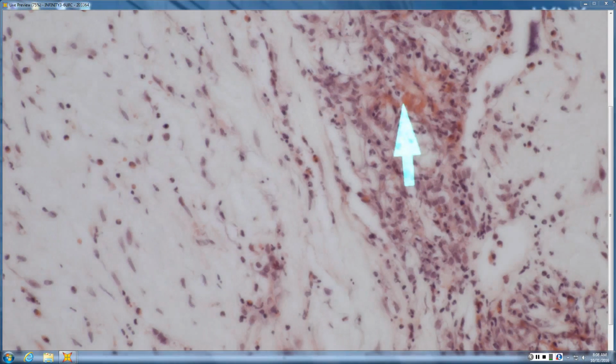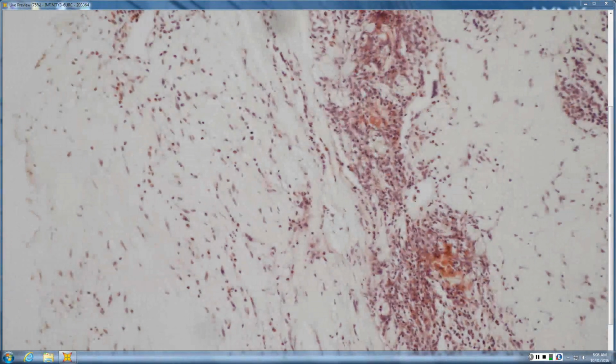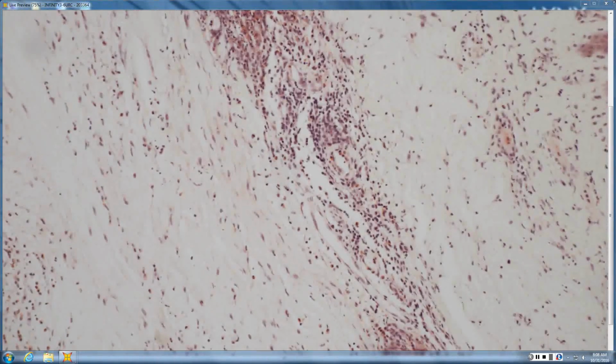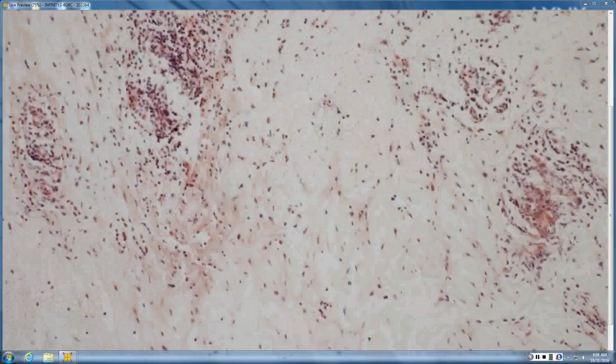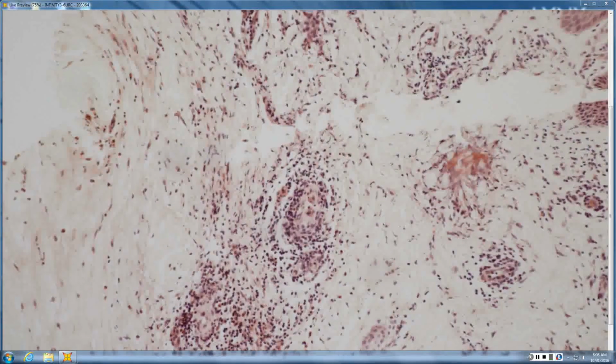So more like Wells syndrome? Yeah, like flame figures of Wells. So let's go back to scan. Those are flame figures like in Wells syndrome. And what causes Wells? Kind of mass activation of the eosinophils. Yeah, and 99% of them are probably fancy bug bites.